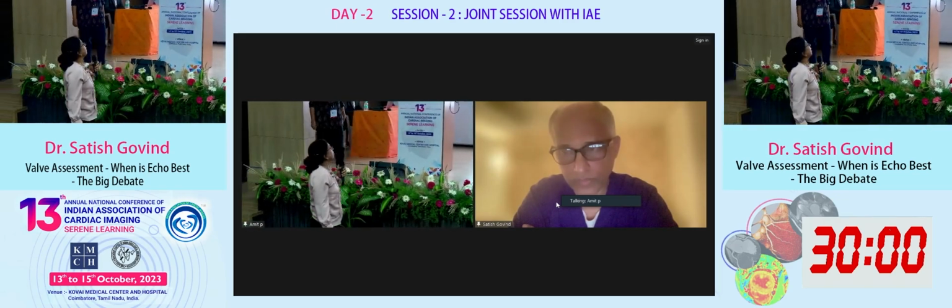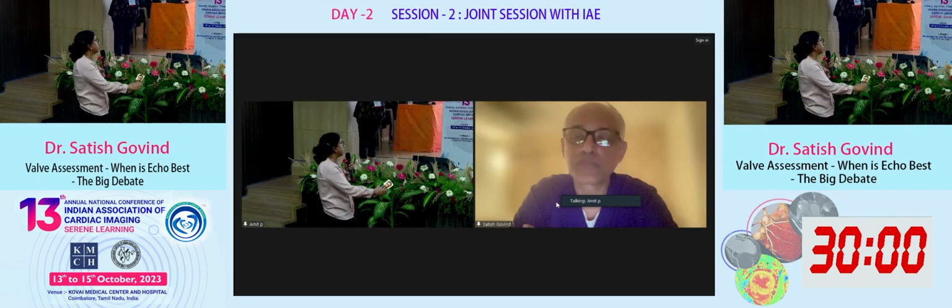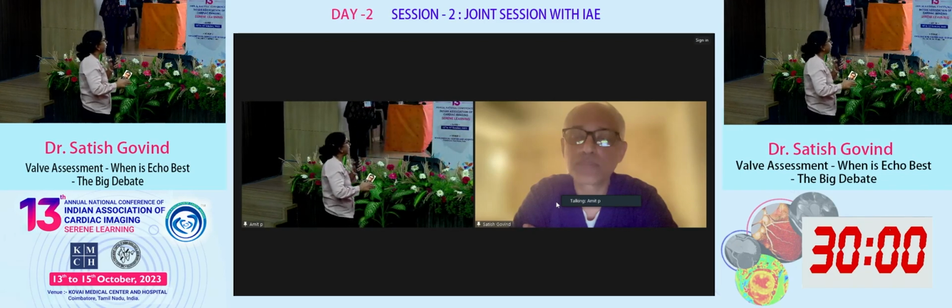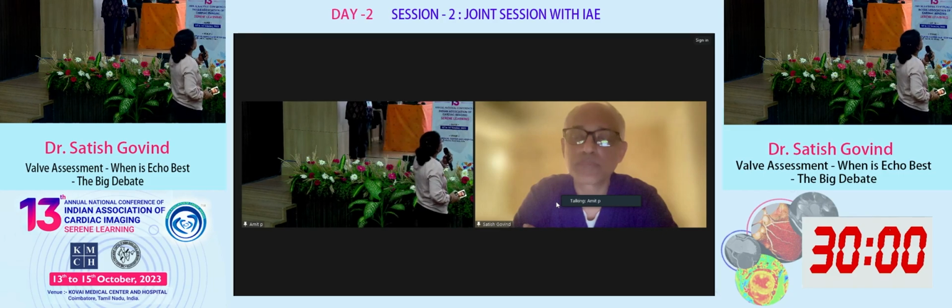We see a lot of Ebstein's where echo... I mean, the surgeons want the cardiac MR to have absolute gold standard reference values. So not exactly valvular heart disease per se, but Ebstein's is where we are.